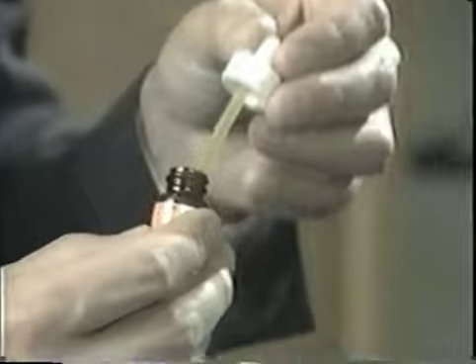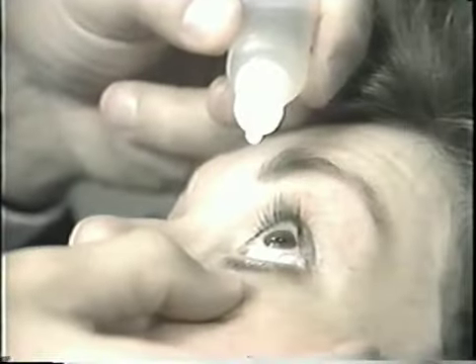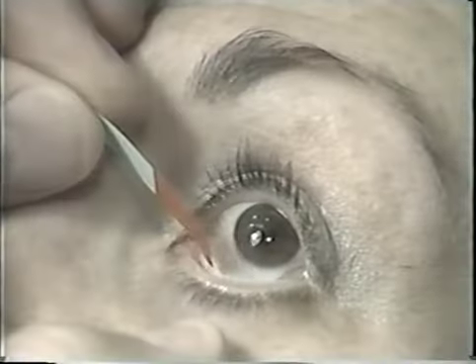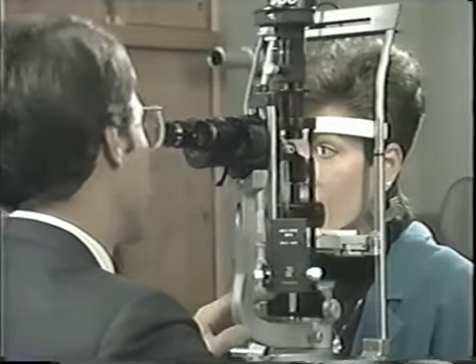Prior to testing intraocular pressure, a topical anesthetic and fluorescein solution, such as Fluoresce, is applied to each eye, and the excess is wiped away. One may also apply fluorescein after administering a topical anesthetic by touching a moistened fluorescein-impregnated strip to the inferior conjunctival cul-de-sac. In order to avoid confusion, check the right eye first, then the left eye.